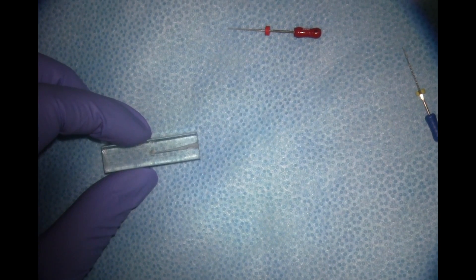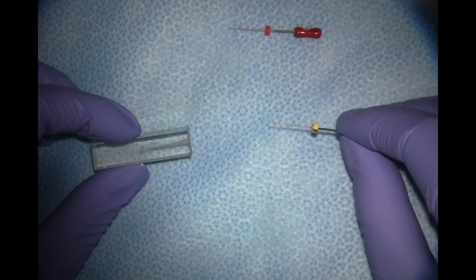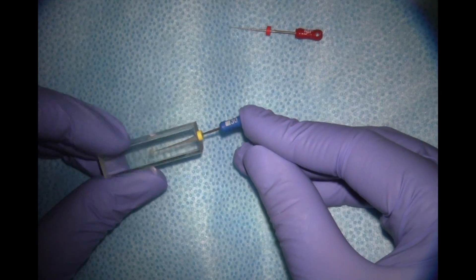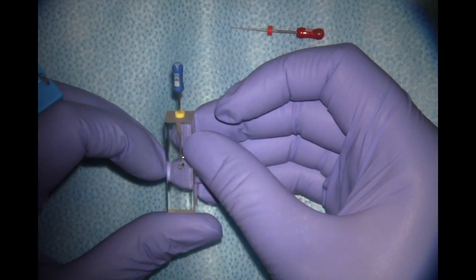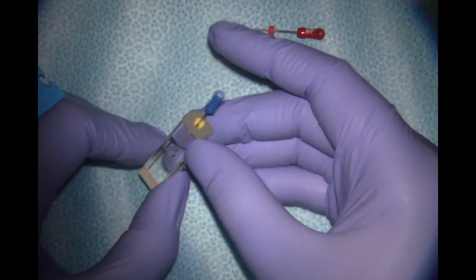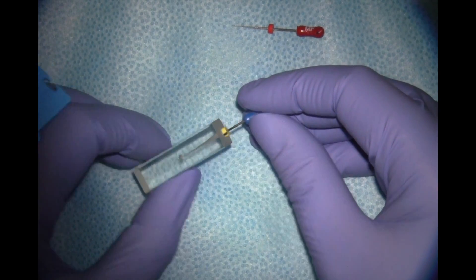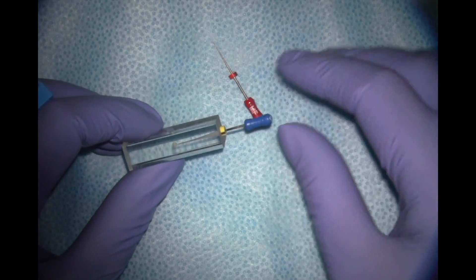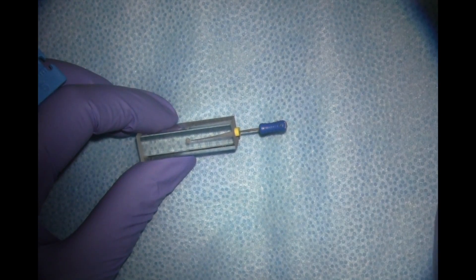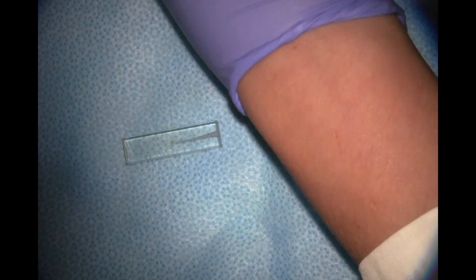Once I'm happy with the taper and seat, I'll take my MAF file shot. If that looks good radiographically, I'm ready to move on with obturation. Before we obturate, as we discussed in lecture, we'll do a final rinse with sodium hypochlorite and EDTA to remove the smear layer, and then we'll dry the canal with paper points.